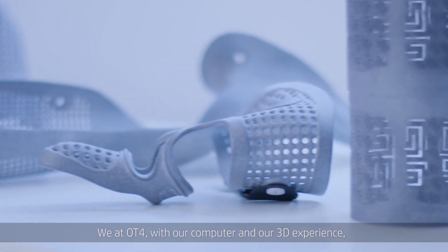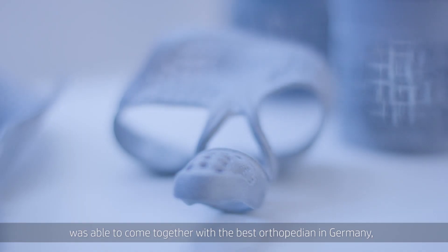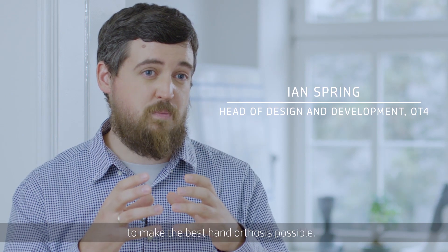We at OT4, with our computer and our 3D experience, were able to come together with the best orthopedic specialists in Germany and develop and collect the ideas to make the best hand orthosis possible.